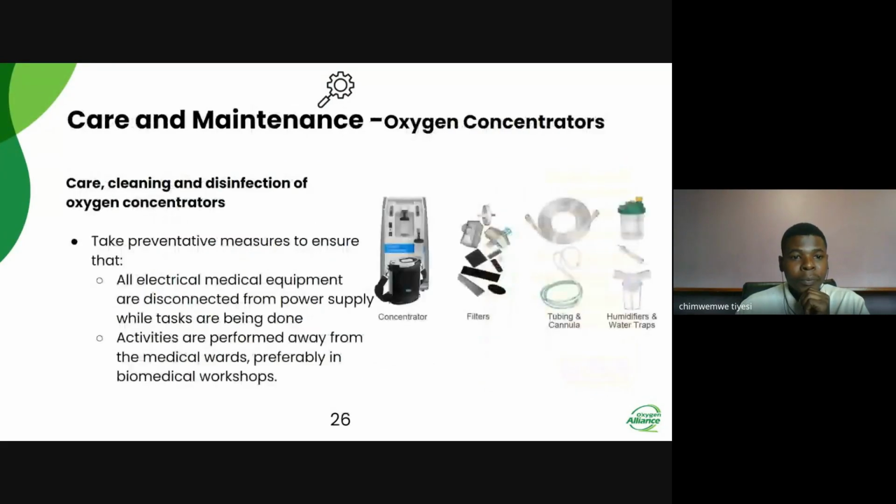Moving on, we are going to look at care, cleaning, and also maintenance of oxygen concentrators. Before you start any cleaning work, you need to make sure that all electrical medical equipment is disconnected from the power supply. That is the medical equipment you want to do the cleaning or the preventive maintenance on. Also make sure that activities are performed away from the medical wards, preferably inside biomedical workshops.